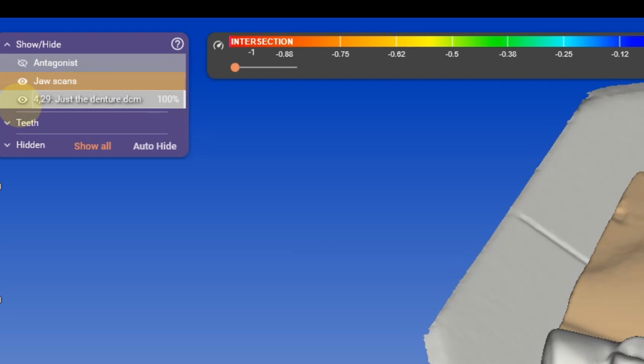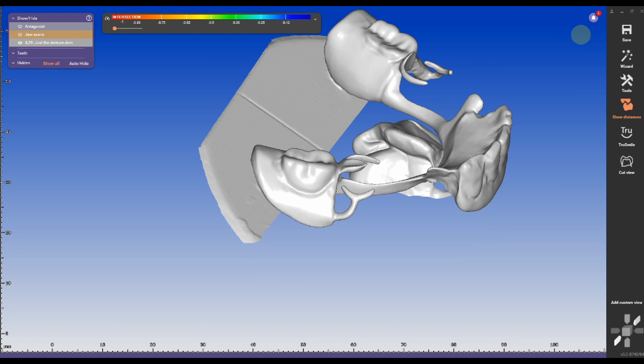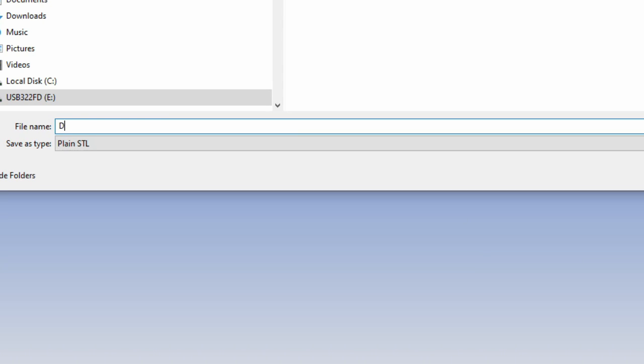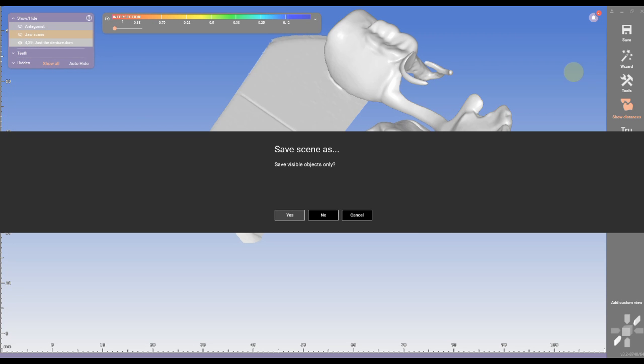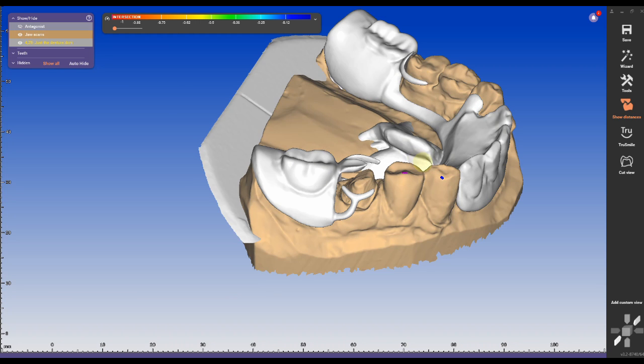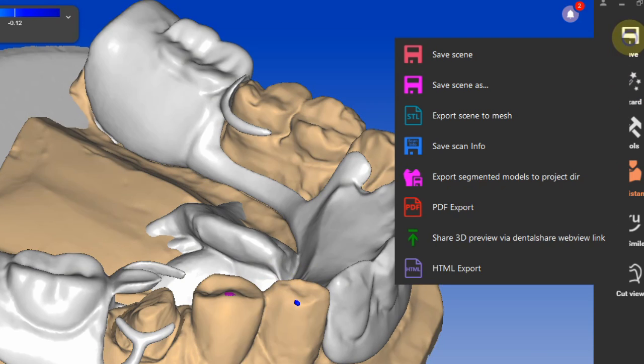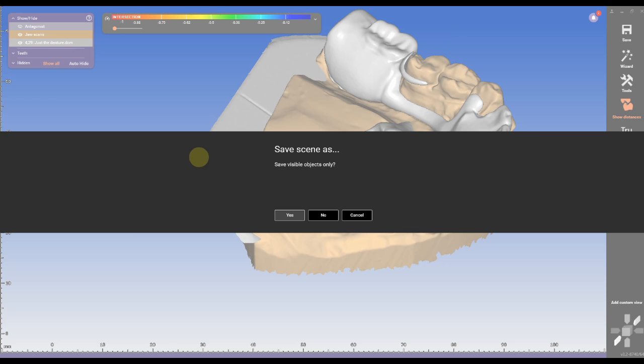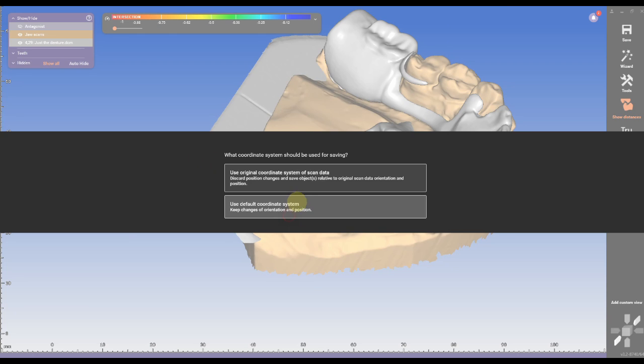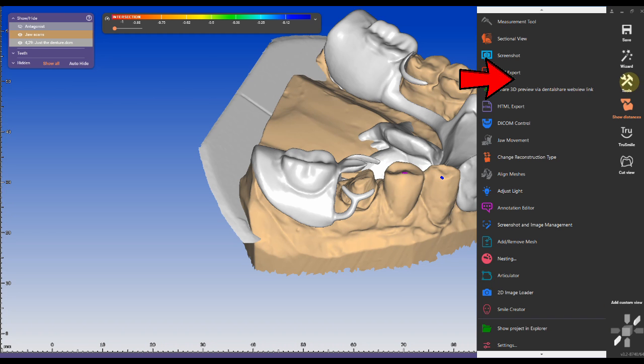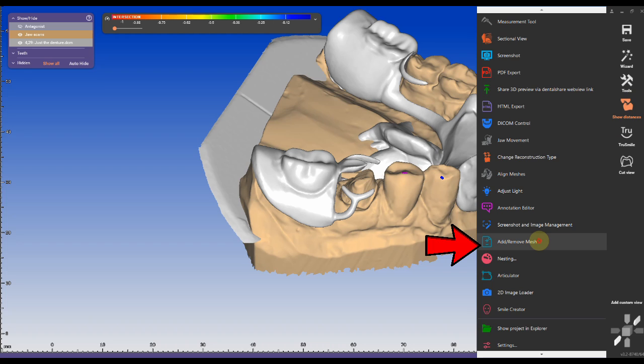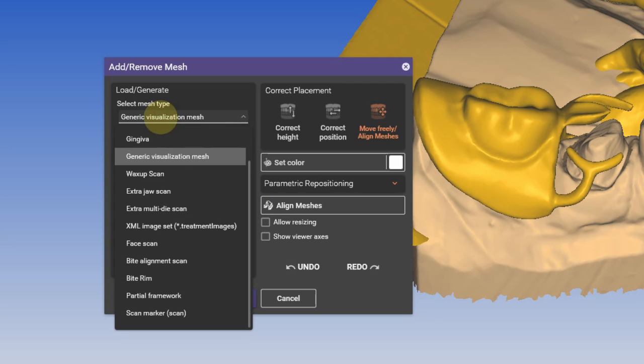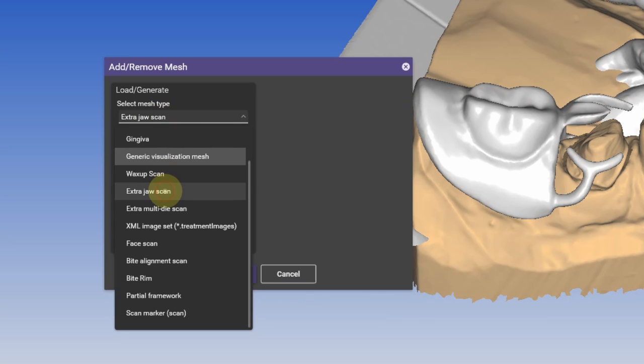Before we get started with the first method, I'm isolating the partial scan and exporting it as a single STL file so I can use it at a later point. I'm making sure it is saved out in the same coordinate system as the preparation scan. Now I'm exporting partial scan and preparation scan as one file in the same coordinate system.